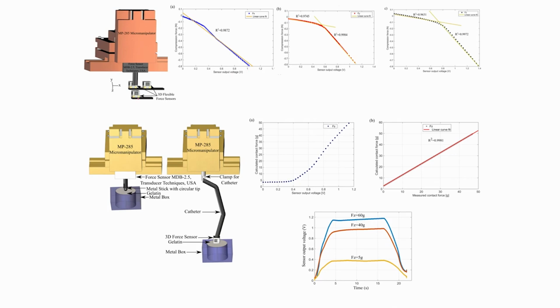Now instead of measuring resistance, we can always use a potential divider to see the change in voltage, or if you use a Wheatstone bridge, accordingly you can see the change in voltage. So when you apply a known force, then you will see the output voltage. From that you can get the data for the fabricated sensor, and from the data you can understand that a certain voltage change corresponds to that particular compression force, right.